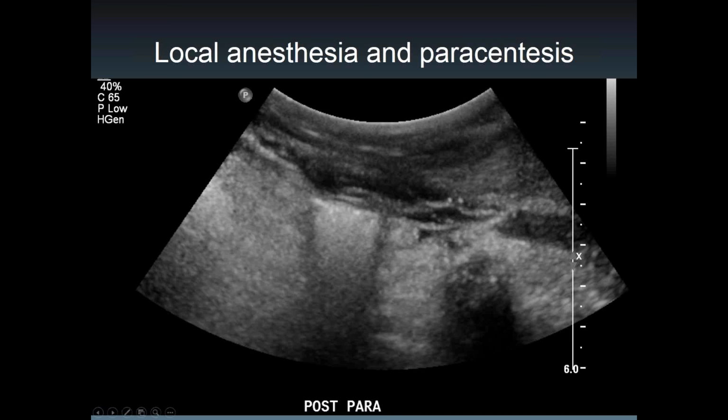Mouse is blocking, sorry. All right, so before we completely leave this patient, what I'm going to show here, the lido pad has another advantage, and that is the original patient's subcutaneous depth was like 5 millimeters, like this one here, right? Once you insert lidocaine, you're going to increase this distance here from the skin, which gives you more leeway to do what we call the Z-track approach, which is like you don't go straight in, but you're trying to artificially lengthen the trajectory.